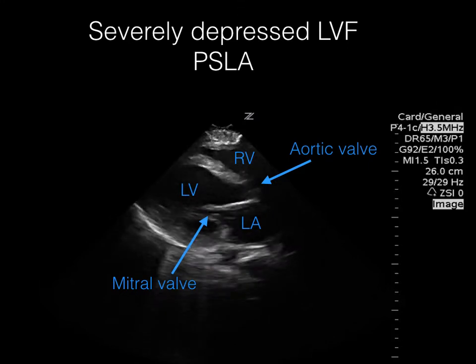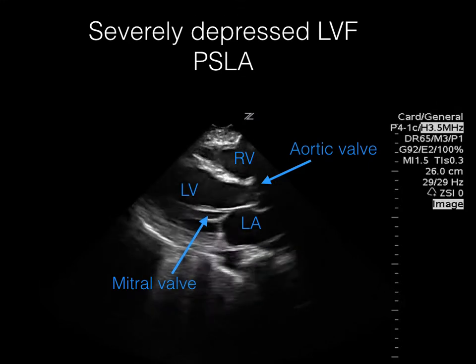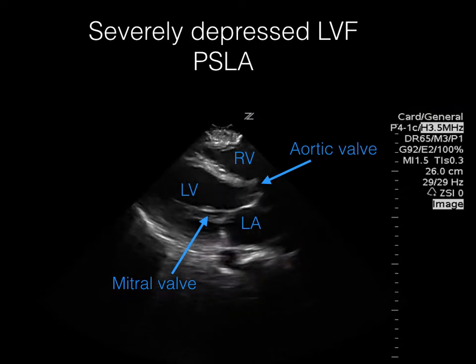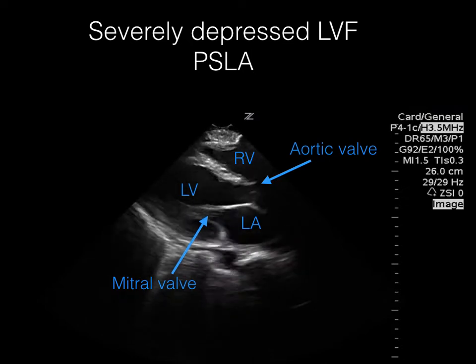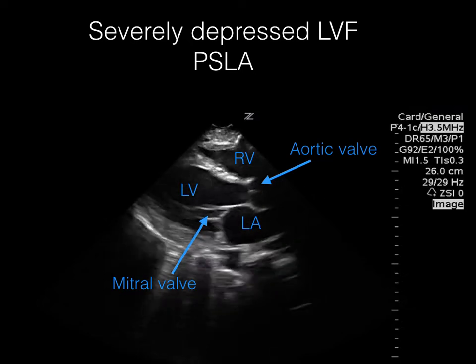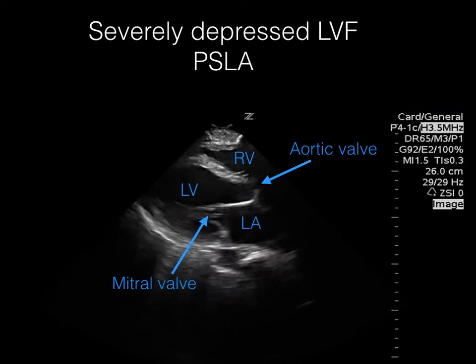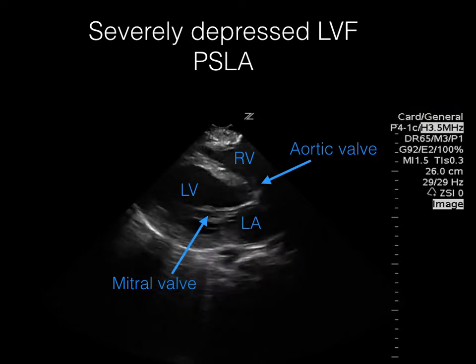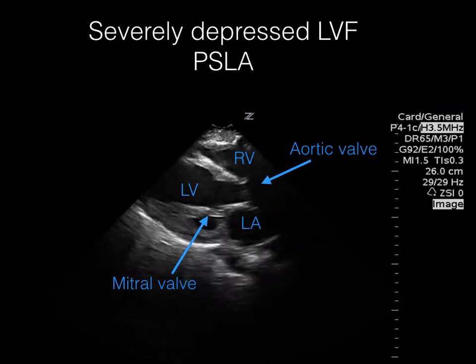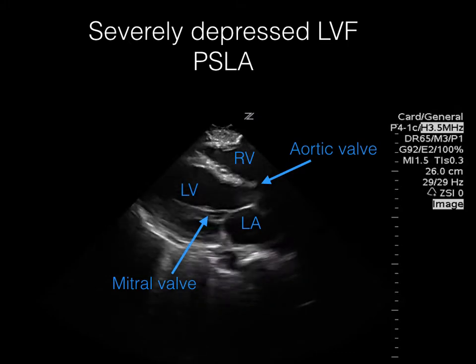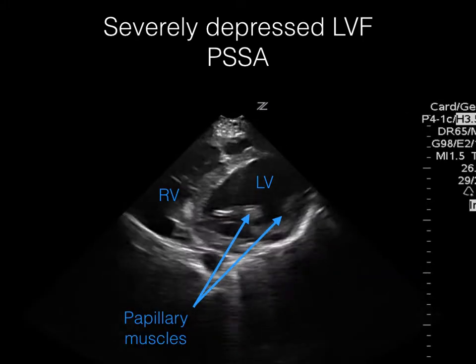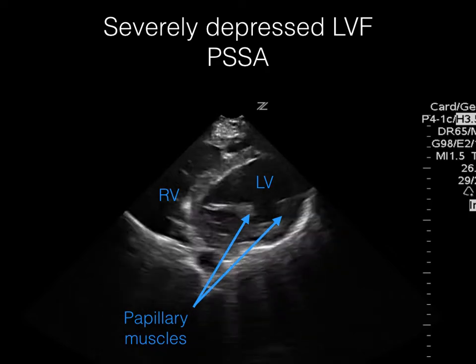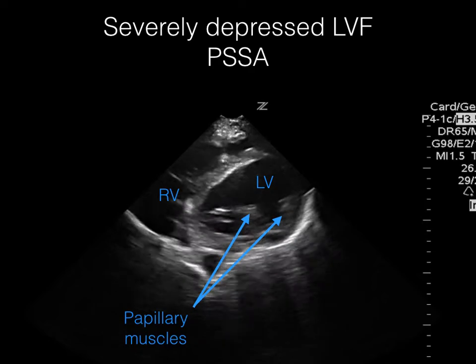Here is a parasternal long axis view. We can see that the anterior leaflet of the mitral valve clearly does not come close to the interventricular wall, and the fractional shortening does not show a significant change in diameter between systole and diastole — certainly less than 30%, measured at the level of the papillary muscles. In this parasternal short axis view at the level of the papillary muscles, we see a fractional shortening of less than 30% between systole and diastole.